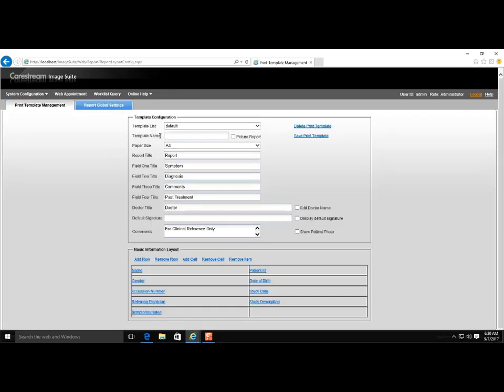Enter the Template Name. Enter the Report Title.